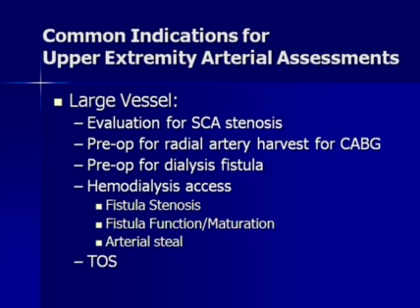Now, in terms of the upper extremity assessment, why do we ever wind up doing ultrasound on some of these patients? Well, probably one of the big indications would be to look for subclavian artery stenosis. Again, large vessel disease is not common, but it can occur. Most patients with subclavian artery stenosis remain asymptomatic. They don't even know they have it.